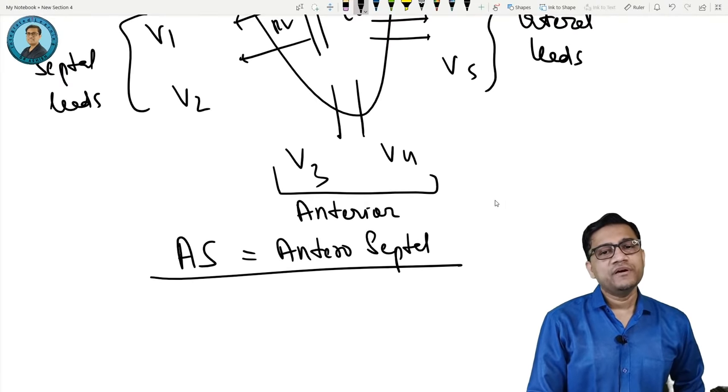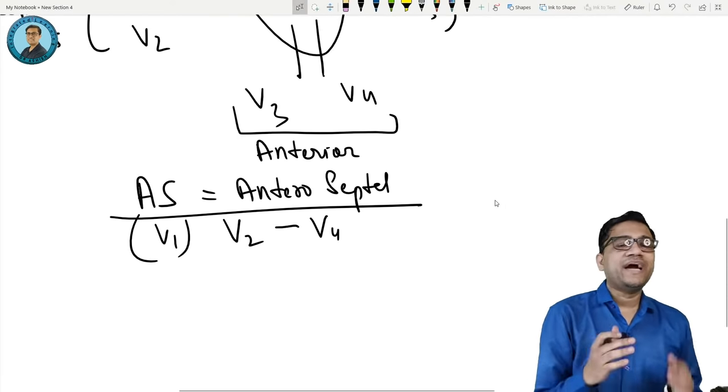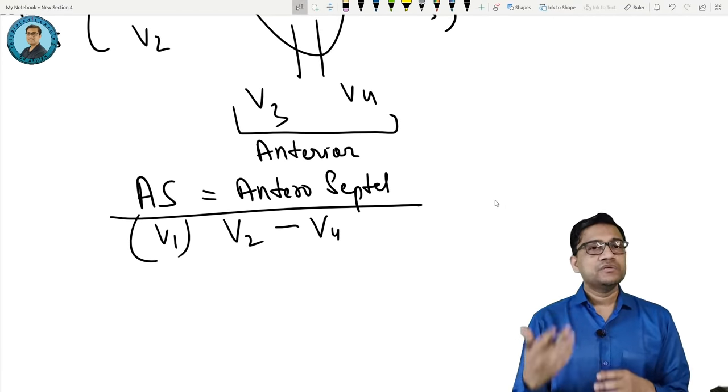Anteroseptal. So, what is the term? We can take V2 to V4. Some books say add V1 also. I put it in brackets. So, this is called anteroseptal. Are you clear? Anteroseptal. Okay, clear?